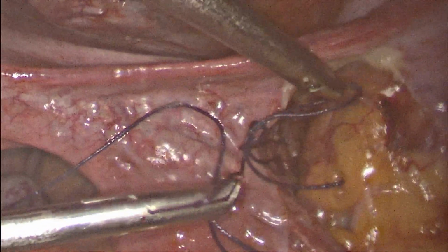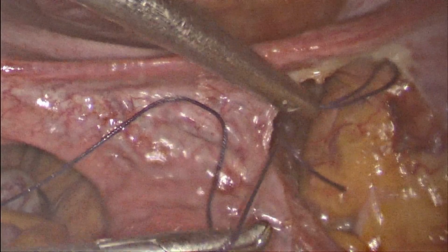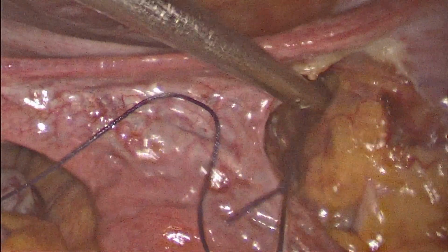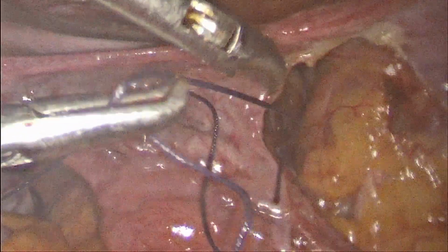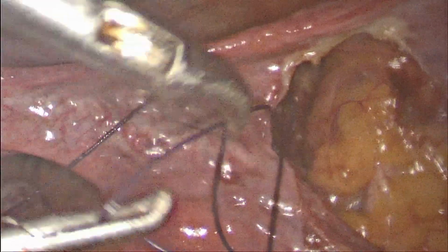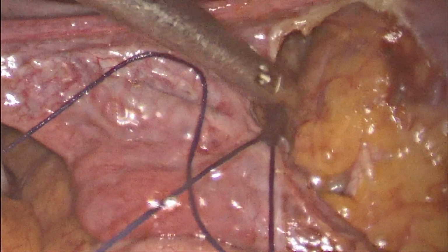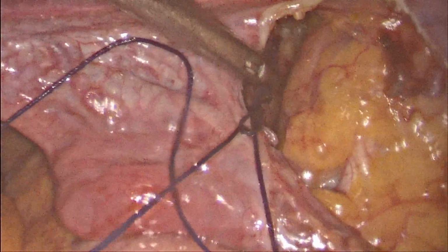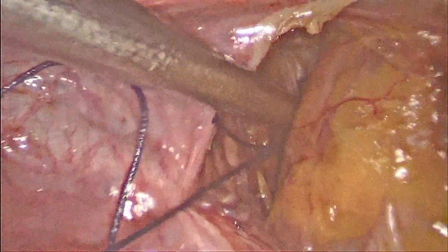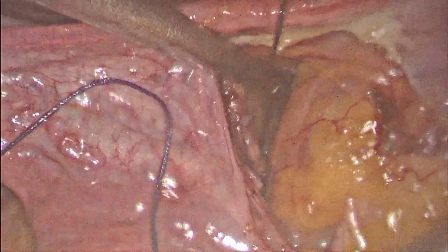Instead, hold it midway between the tying side and the distal end of the short stitch. And then we will tighten it. We will not reinforce the stitch once again. Only one knot is tied, which is sufficient to cease the blood flow from the uterine vessels to the uterus. So that is sufficient.